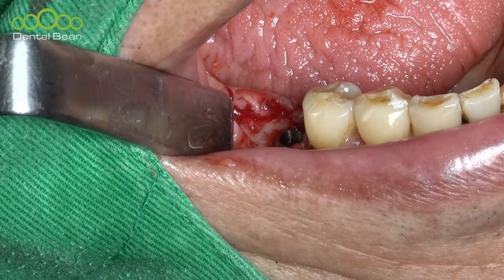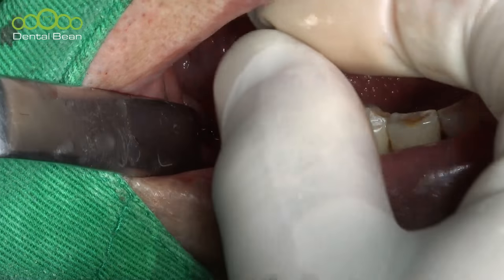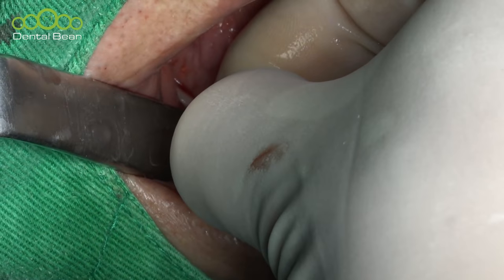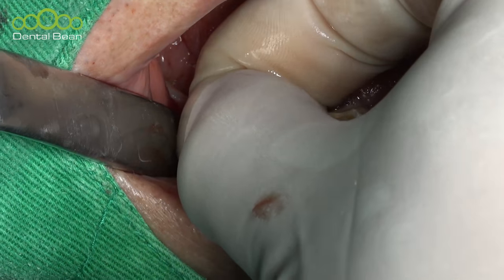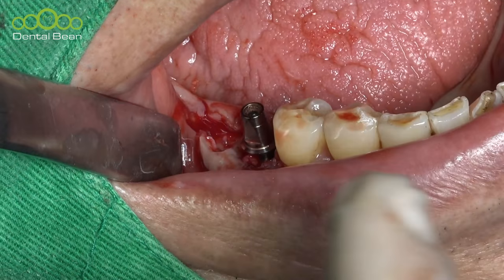This patient, the lower right side, I will try immediate loading here because there is no opposing jaw. So I want to skip the second surgery and then two-piece abutment.